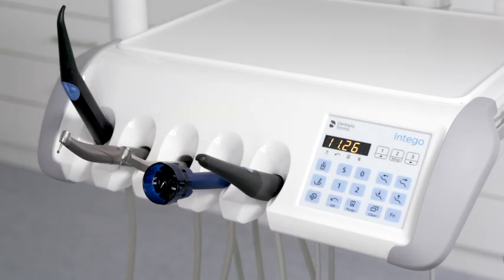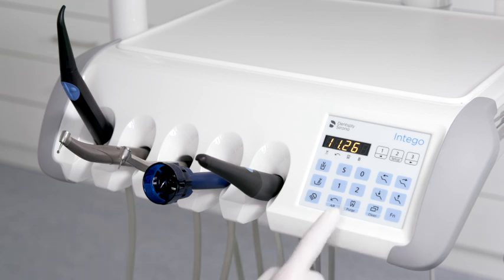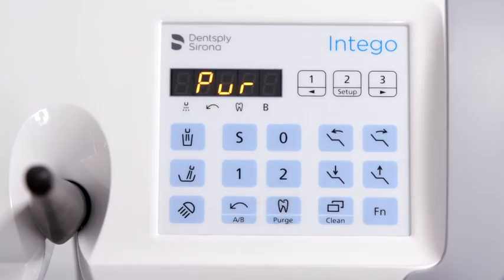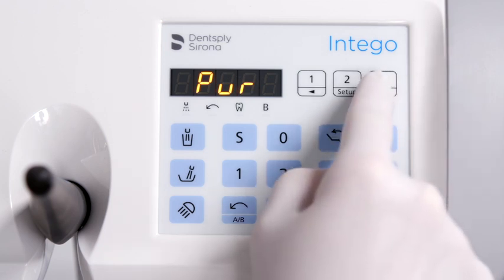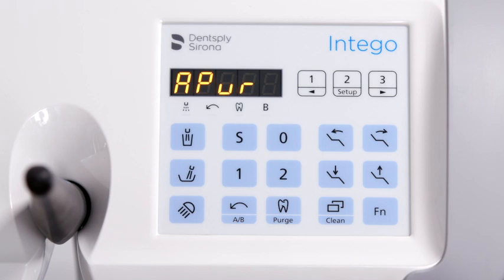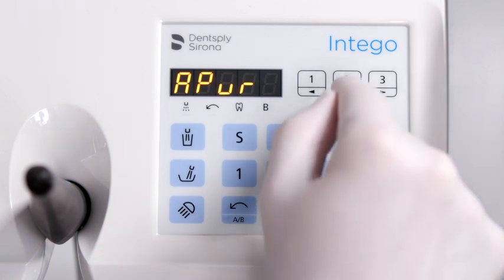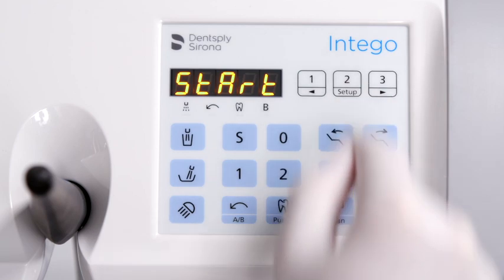If available, use the auto purge function to flush the water lines in the morning and evening. With all instruments placed in the holder, press the purge key to open the hygiene programs. Press the right favorite key until the auto purge program is visualized. Start auto purge by pressing the middle set favorite key.